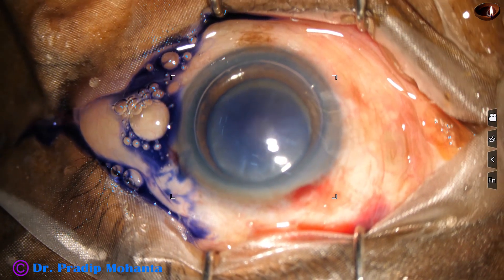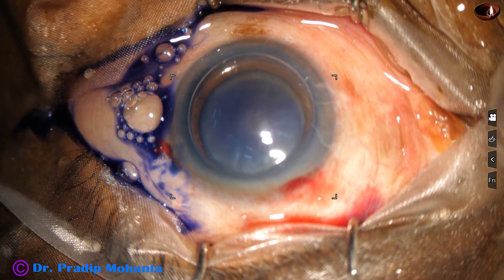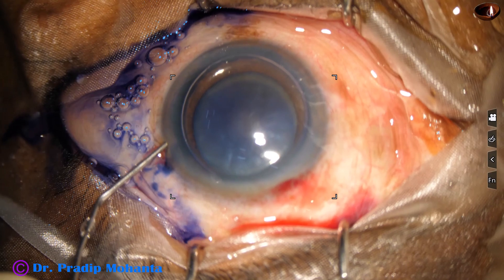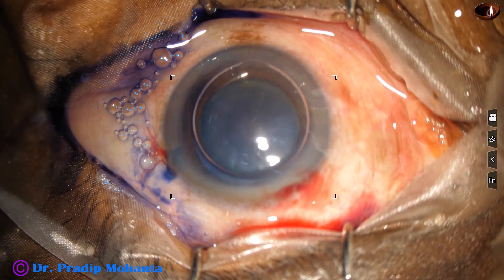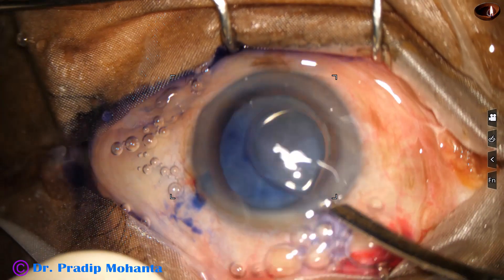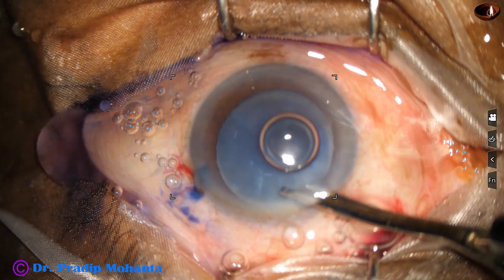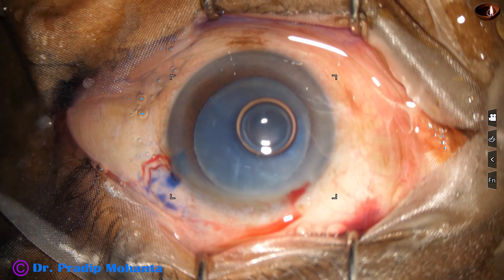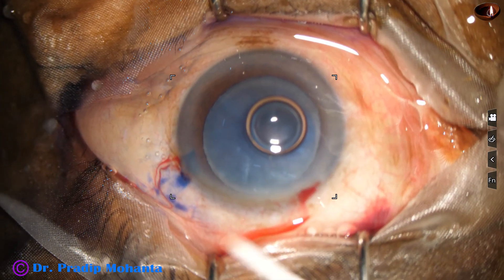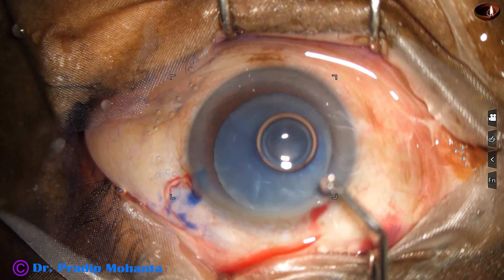An air bubble has been injected and underneath this air bubble the trypan blue dye is applied to stain the anterior capsule. The dye is washed out and then the anterior chamber is filled up with 2% hydroxypropylmethylcellulose.